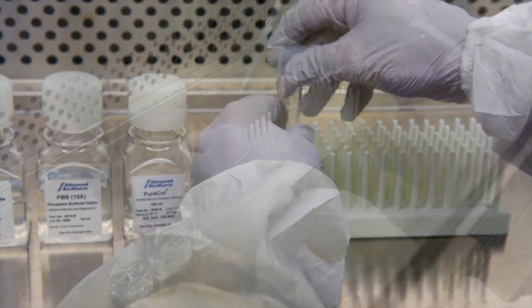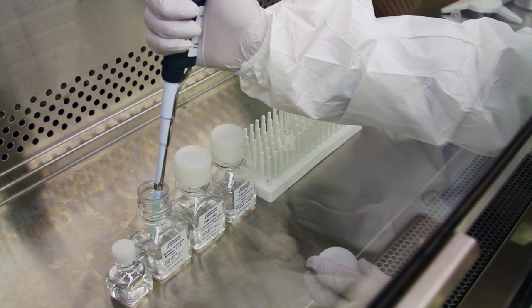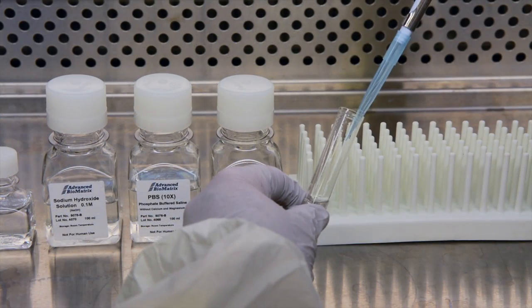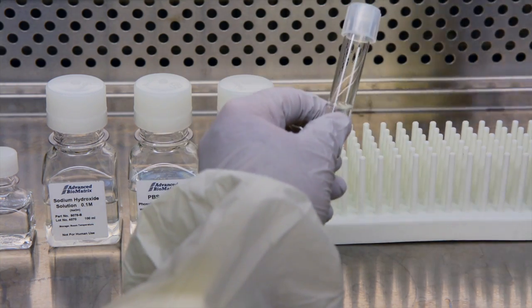Using sterile 0.1 molar sodium hydroxide, adjust the pH of the collagen mixture to a pH of 7 to 7.4. In our example, titrate the collagen mixture with approximately 0.375 ml of 0.1 molar sodium hydroxide.